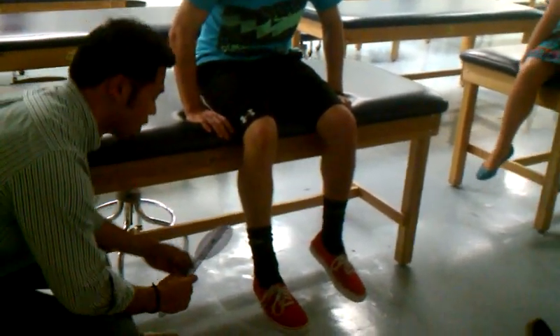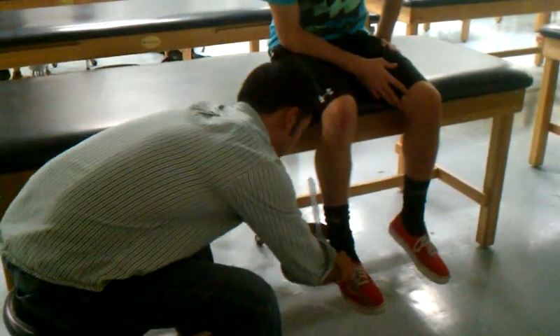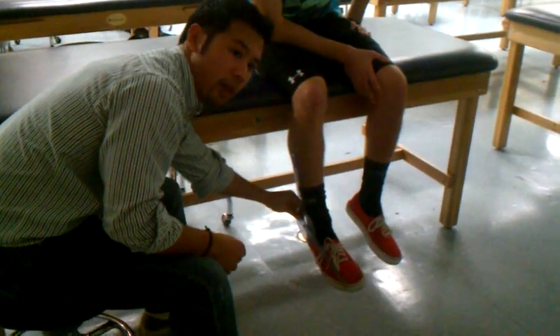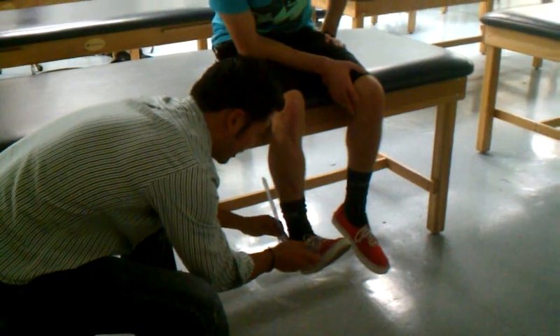At the foot, flexion and extension is measured from the lateral side. At 90-90, the axis is going to be the lateral malleolus. The stationary arm is lined up with the fibular head. The moving arm is parallel to the fifth metatarsal — same rule as with the wrist. Because I'm lined up with the lateral malleolus, the moving arm won't be directly on the fifth, it'll be parallel to it.